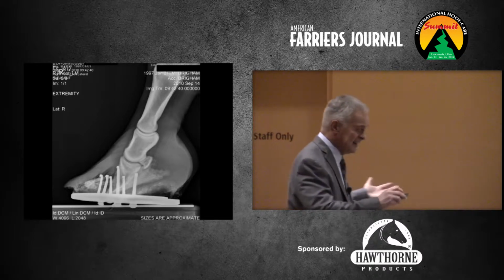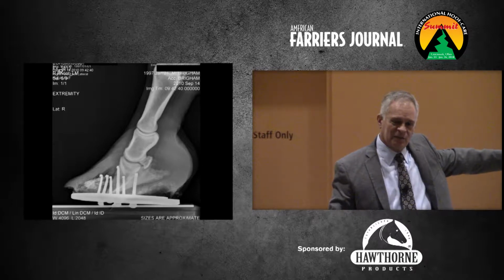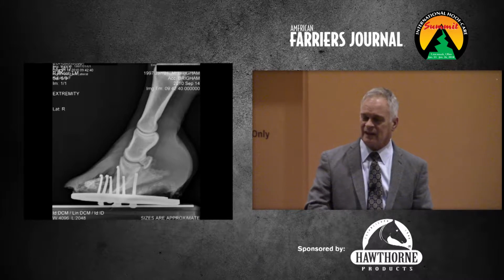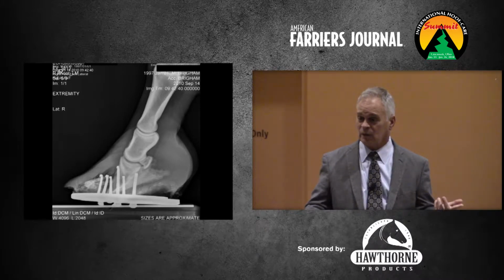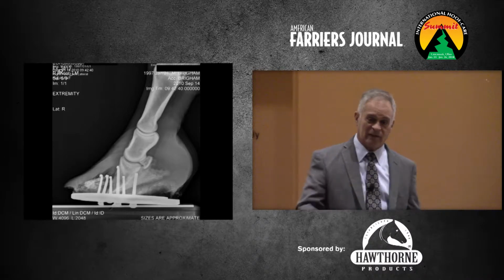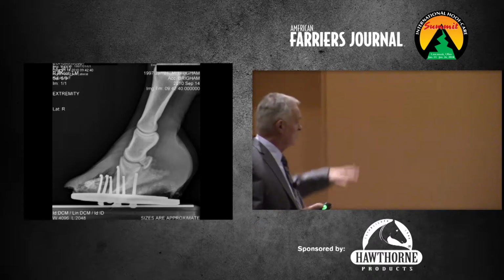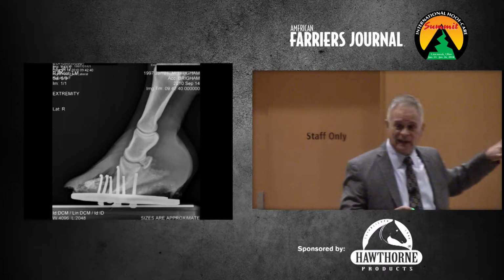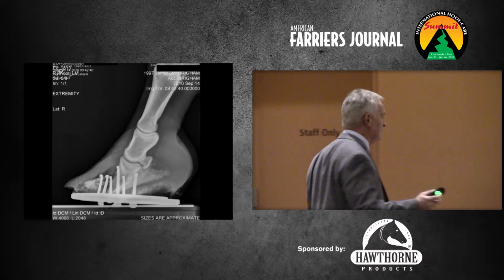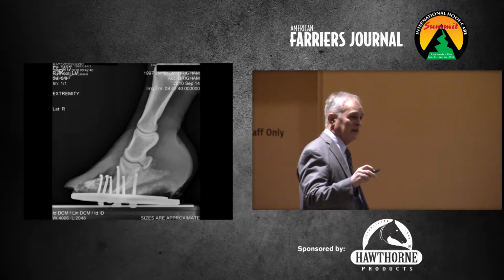All right, so this is a severe white line disease. I don't think he got to this one yesterday. It has become so extensive it destabilized. It's not a laminitis, which is why it could walk in like that, but it's lost the structural connection. The lamellae are fine, but it's just collapsed. So again, the radiograph would surely highlight to the owner how bad that is, and would be very helpful in illustrating to them what needs to be done and how difficult this is going to be.